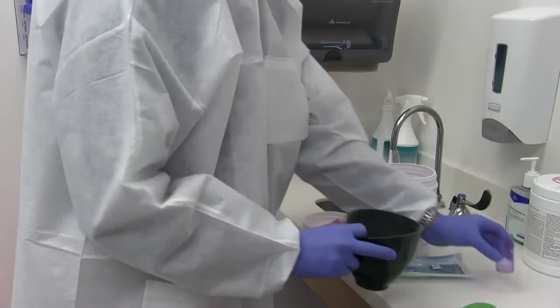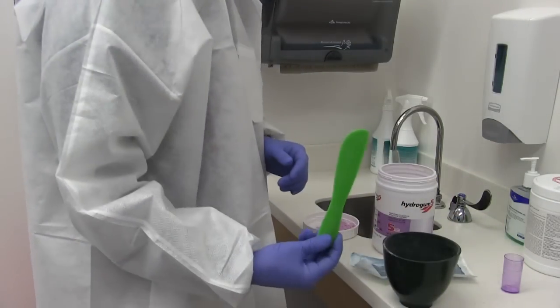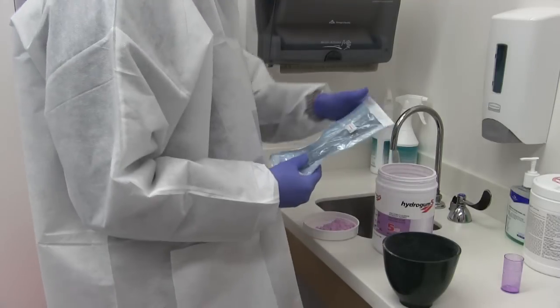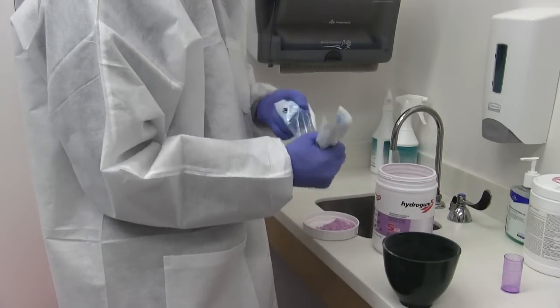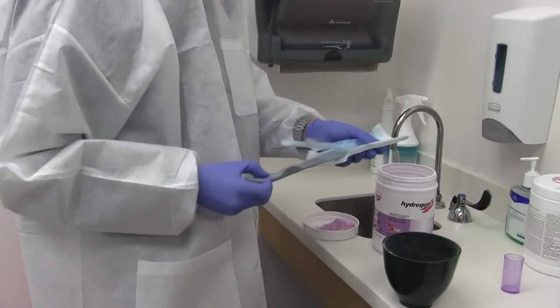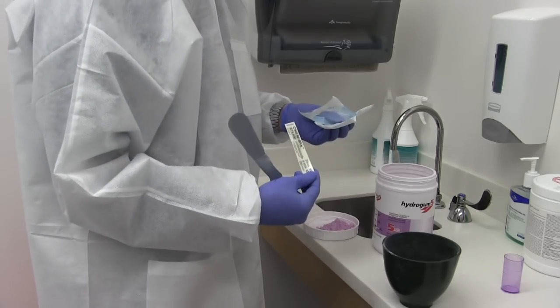Putting water in first — this can be deionized or distilled water — based on the manufacturer's recommendations. The green spatula I just showed you is flat on one end. This one I'm opening up now has a rounded edge on both sides, which makes it easier to triturate.